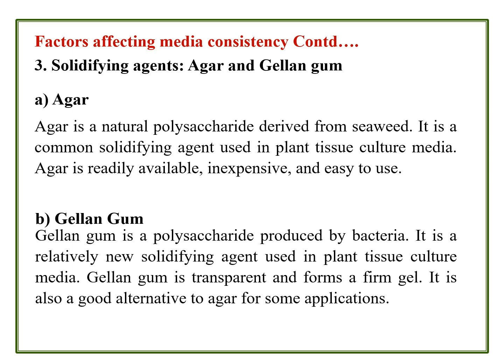Agar is a natural polysaccharide derived from seaweed. It is a common solidifying agent used in plant tissue culture media. Agar is readily available, inexpensive, and easy to use. Generally, when agar is incorporated in plant tissue culture medium preparation, the medium is known as solidified or agarized medium.